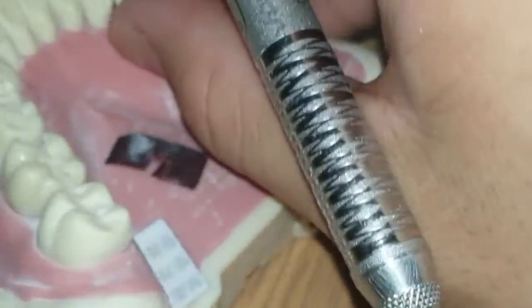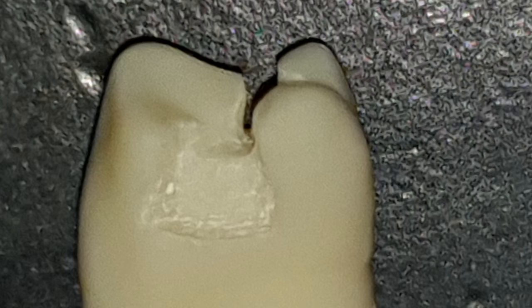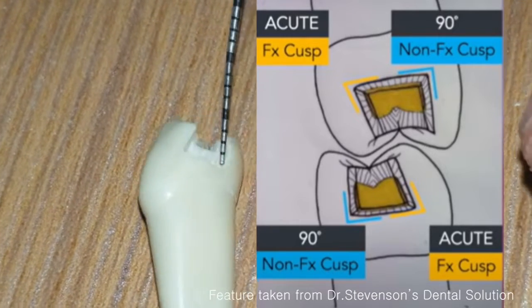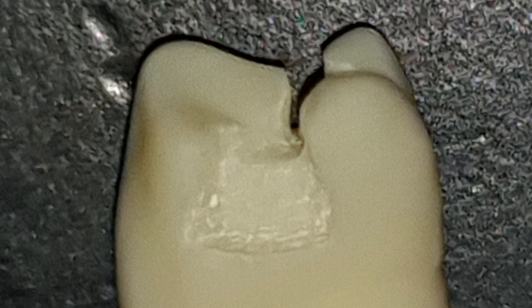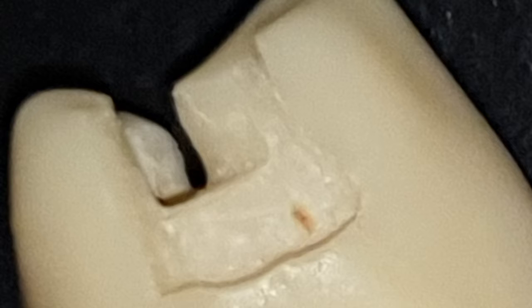Let's extract the tooth. I've failed to smooth this corner. The proximal box form is okay — it is beautiful. Since this is the functional cusp, the angle was made like this. The functional cusps have a divergency. Making the distal side of the box was a little bit more difficult, because it is away from direct vision.